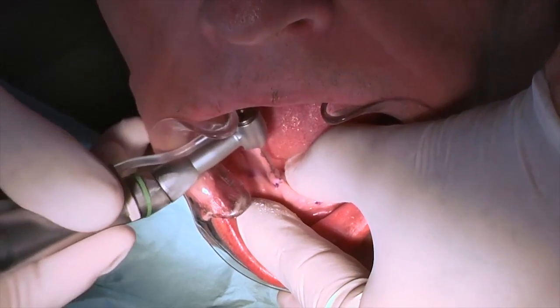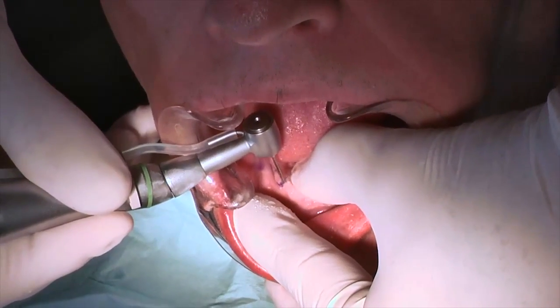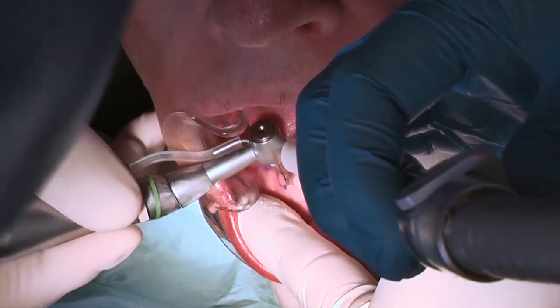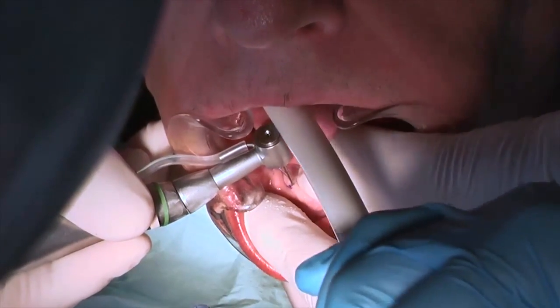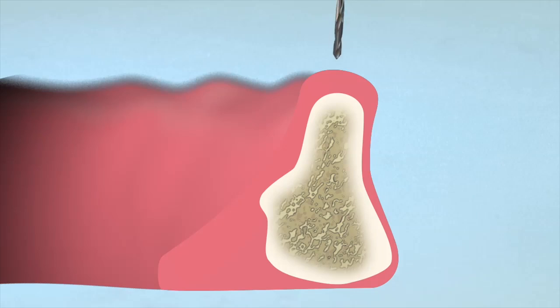Always place implants from the outside in. Use the 1.1 mm pilot drill bit by placing it at the entry point and lightly pumping at a speed of 1200 to 1500 RPM until the cortical plate is penetrated. Carefully advance the drill to create a pilot hole between one-third to one-half of the length of the threaded portion of the implant. Do not overextend the hole.